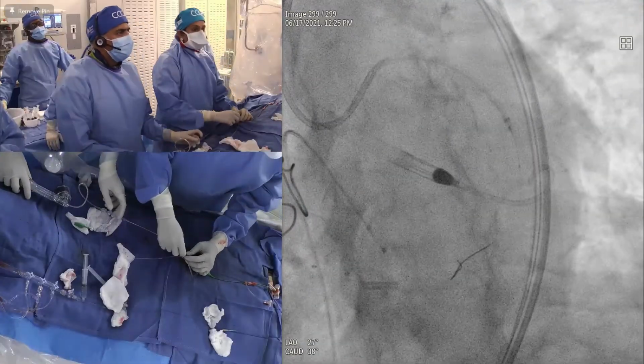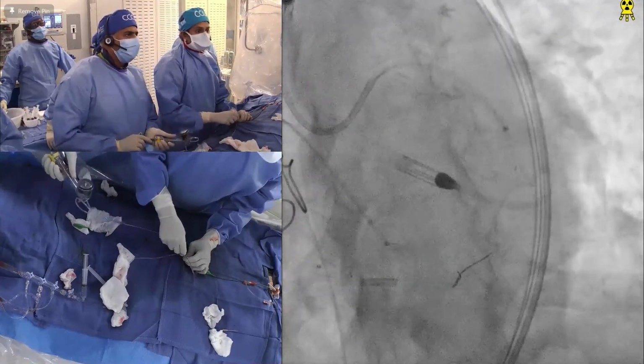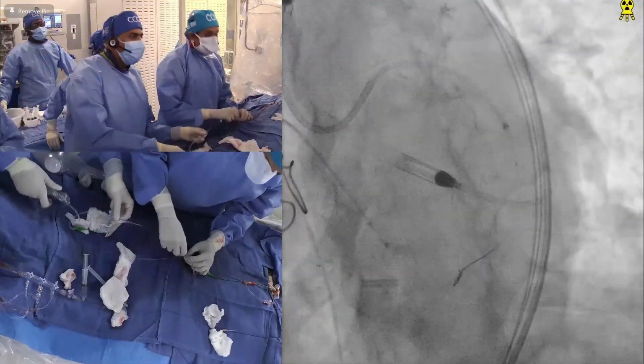Balloon. Let's just do it while we're there. You can put it back in a second. I think we did. Again, I don't know. It's in a good spot. Okay. We'll never get it. Okay, get the stent again.